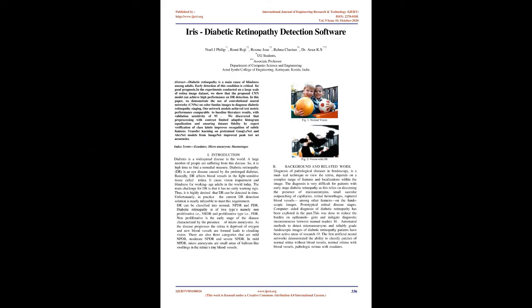Diabetic retinopathy, DR, is an eye disease caused by prolonged diabetes. Basically, DR affects blood vessels in the light-sensitive tissue called retina. It causes vision impairment and blindness for working-age adults in the world today. The main challenge for DR is that it has no early warning sign. Thus, it is highly desired that DR can be detected in time. Unfortunately, in practice the current DR detection solution is nearly infeasible to meet this requirement.